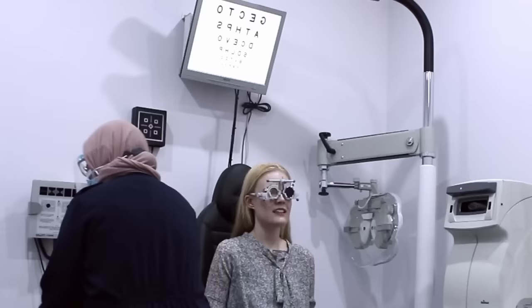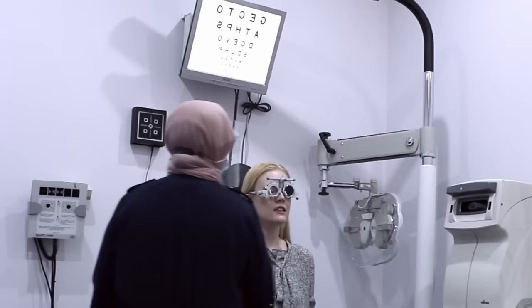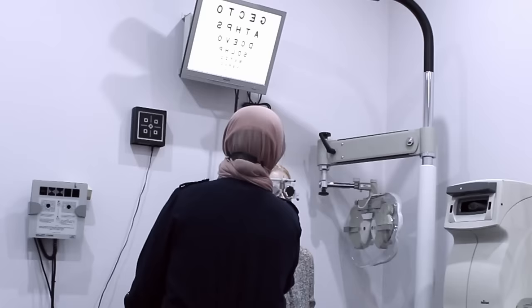Now, if you look at the top line, look at the letter O at the end. Keep watching the letter O. Do you see much difference between that one and that one? This is very similar. One's clearer. This one's slightly more foggy. This is slightly clearer, yeah?